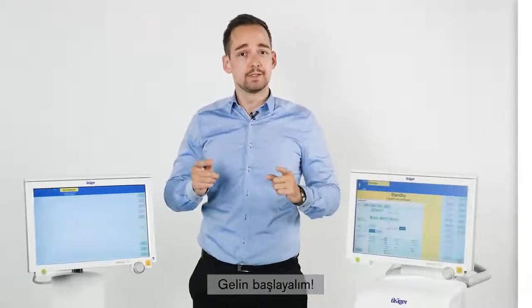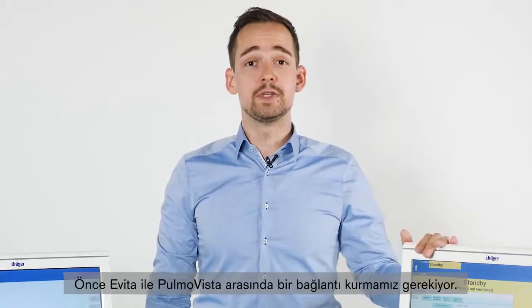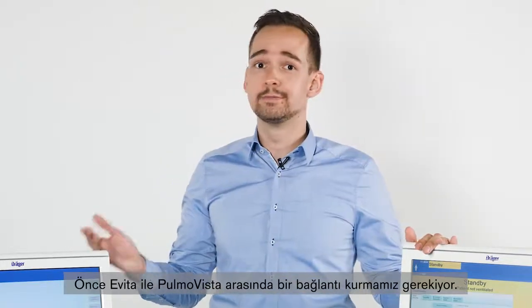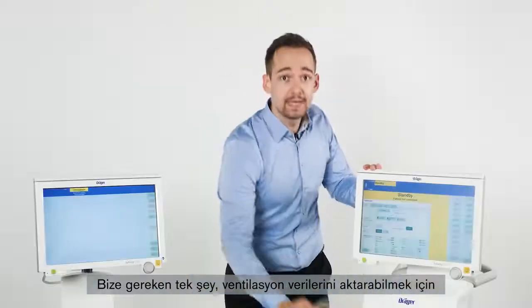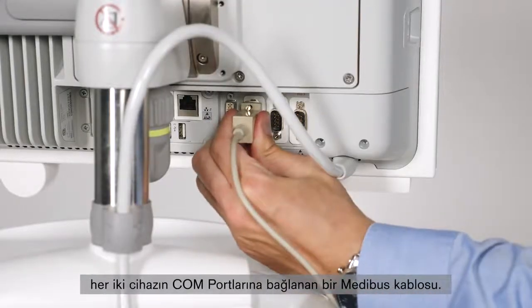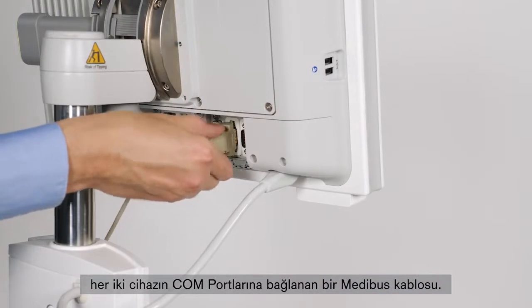So let's get started. First, we need to establish a connection between the Evita and PulmoVista. All we need is a Medibus cable which is connected to the COM ports of both devices to transfer ventilation data.